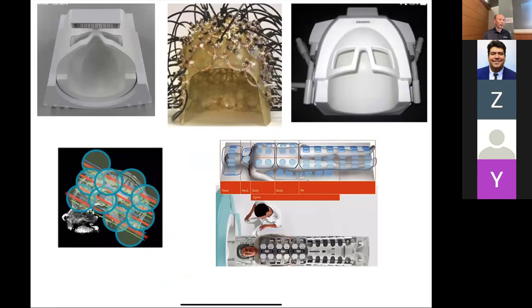And the real key to making all this work is the fact that we have different coils. And it sort of makes sense. Previously we're counting on the Fourier transform to do all the work. We're saying here's an object, you've got to sample it and go out far enough in k-space. You've got to figure out everything. But if you had a bunch of coils on someone's head, like I put a coil here, it's going to be sensitive to this part of my head.